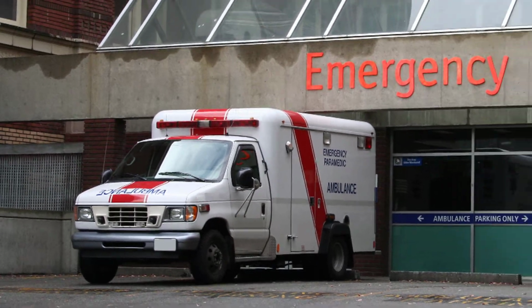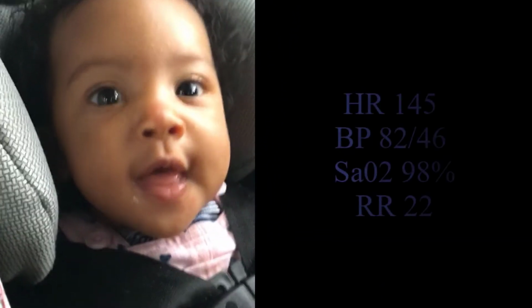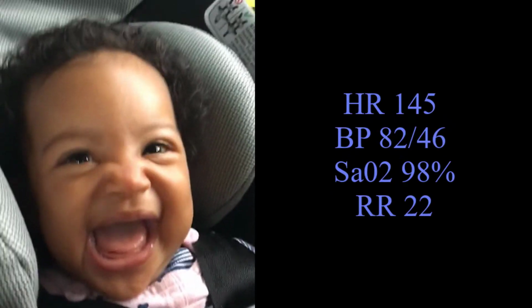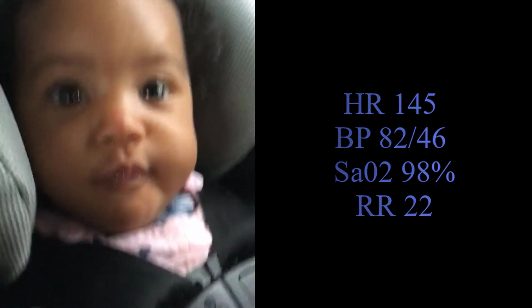Pediatric trauma is rare at your facility, but your team prepares a resuscitation bay. You walk along the stretcher while the ambulance crew brings the patient to their room, and are reassured by their overall stable appearance. The patient has a heart rate of 145, blood pressure of 82/46, oxygen saturation of 98%, and a respiratory rate of 22.